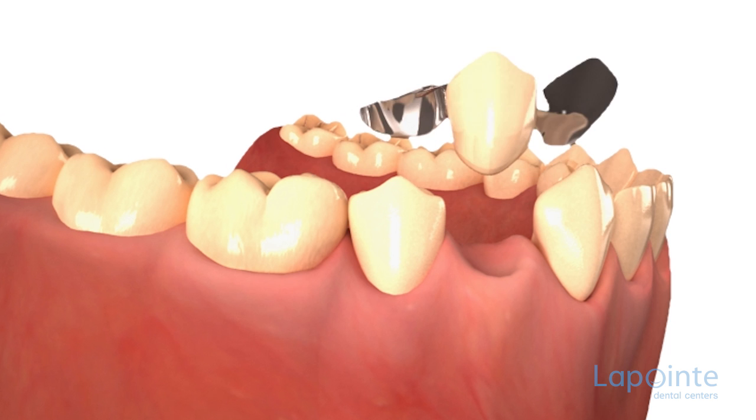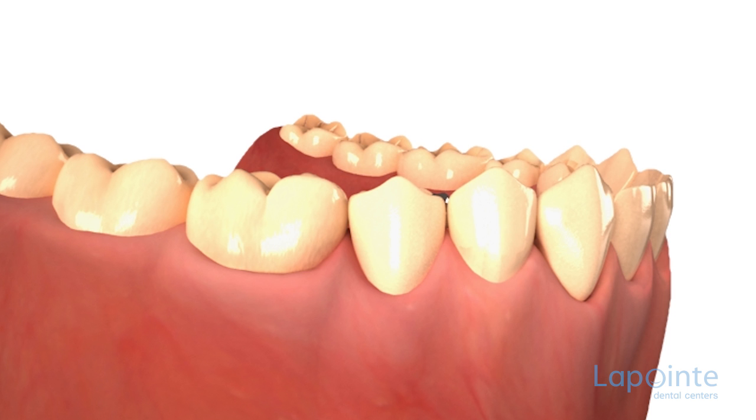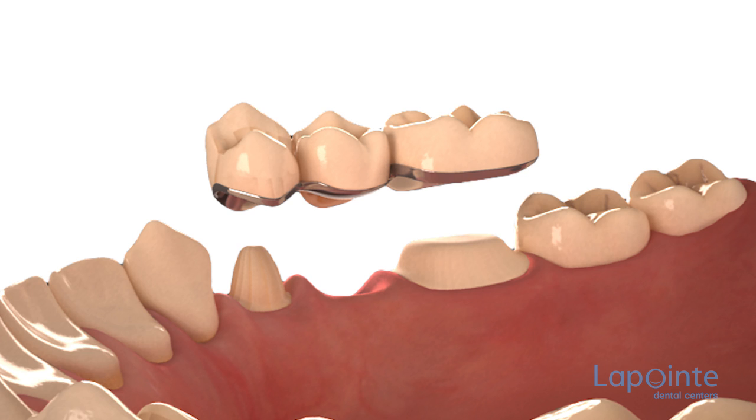The butterfly bridge can rarely replace more than one or two teeth and is fixed in place with metallic wings glued to the hidden surface of the teeth on each side of the space to be filled.